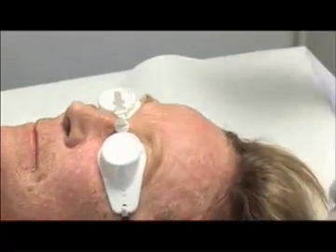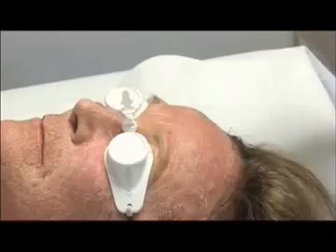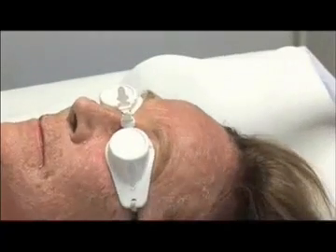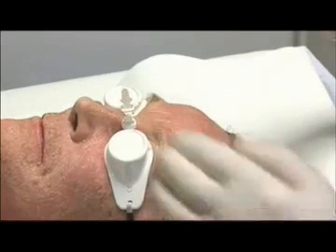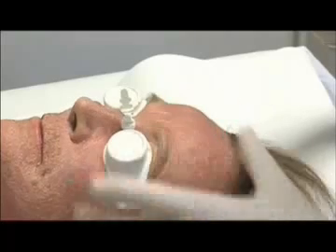Here we are halfway through the treatment. We have performed the first passage of treatment of the epidermis. Now we will perform the second passage, which will lead to dermal retraction.